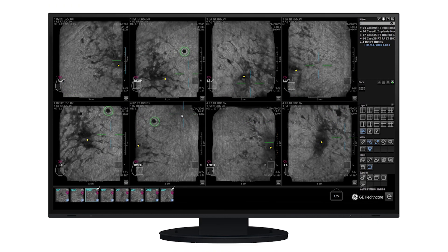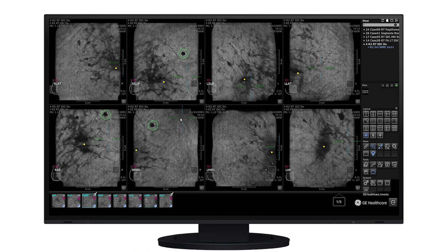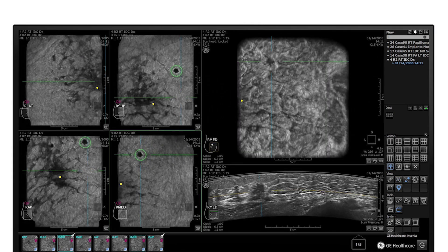Invenia A-Bus users can further investigate areas of interest with the Invenia A-Bus viewer layout. When a viewer selects a marker on the synthesized volume or specific image, this review mode displays the corresponding coronal and transverse view.